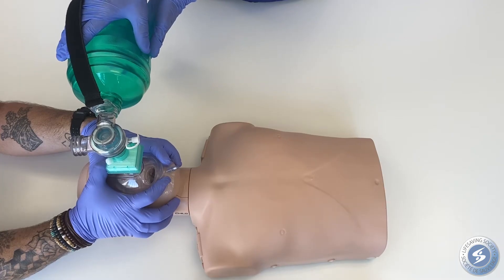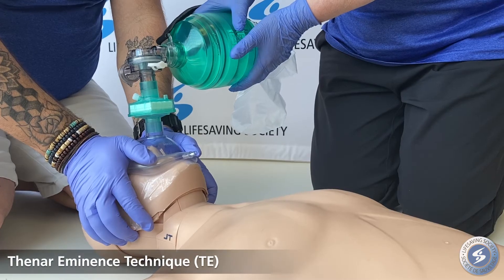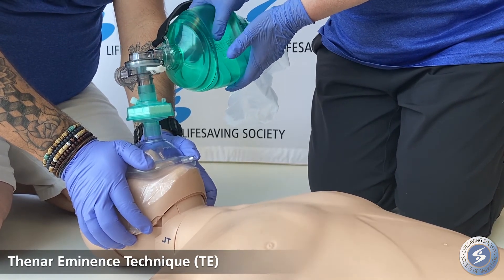There are two different techniques to seal the mask: a CE clamp, seen here, and the thenar eminence technique, also known as the two thumbs down technique or modified jaw thrust.